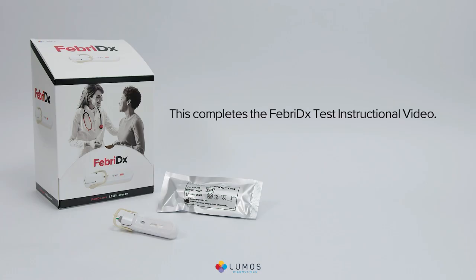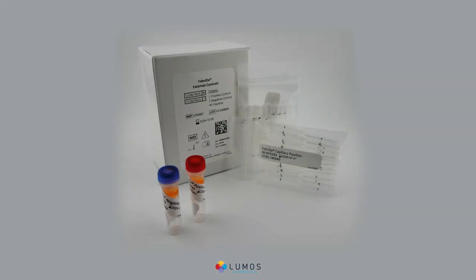This completes the Febridex test instructional video. Febridex has an external control procedure with separate instructions — perform the controls as indicated in the external control instructions.